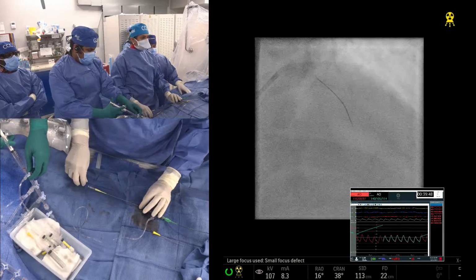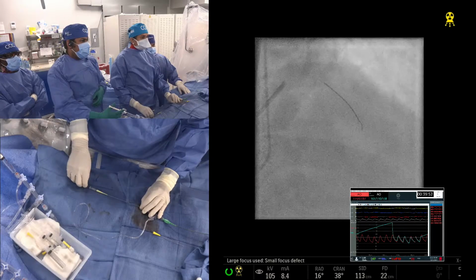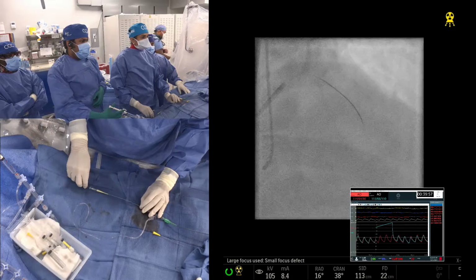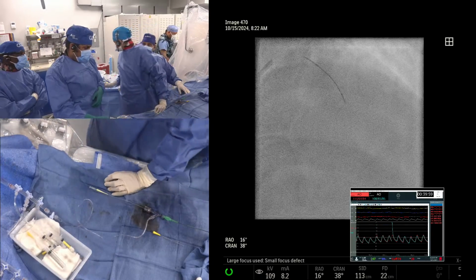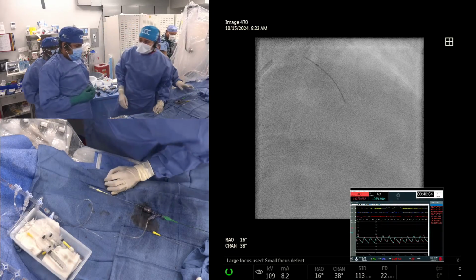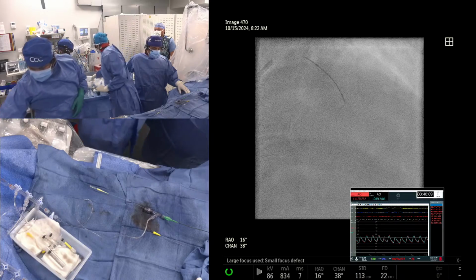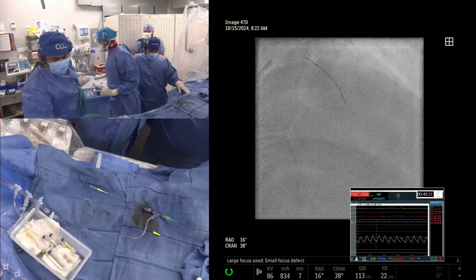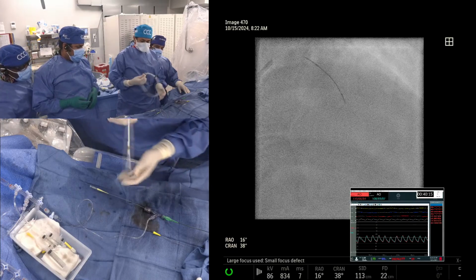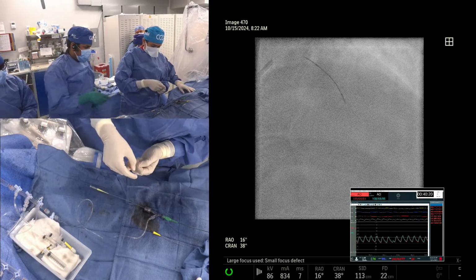But still the staff is involved and fellows are involved. The key is the referral cases. I have designated about 10 interventions, 7 are referred from outside, and two of them have failed outside. You know those cases are very challenging and will take a lot of time. A failed case is included in the complexity and classification. Absolutely, the J-CTO score, a failed attempt, is one of the important factors.